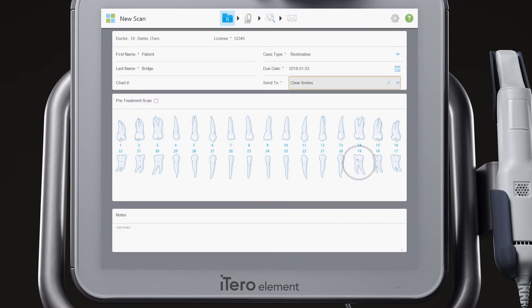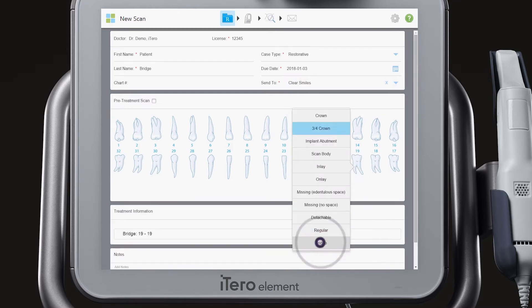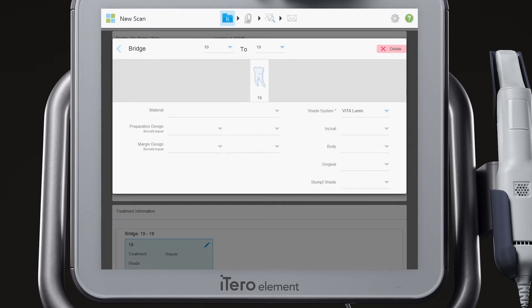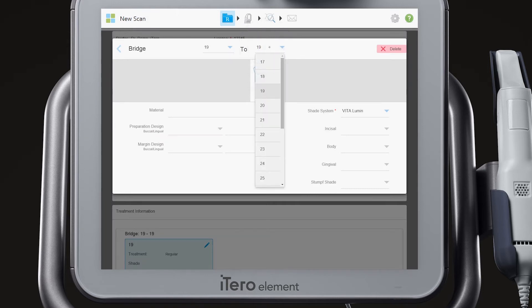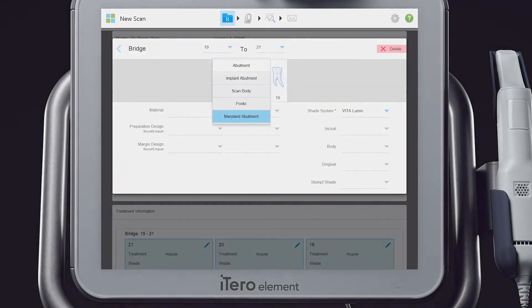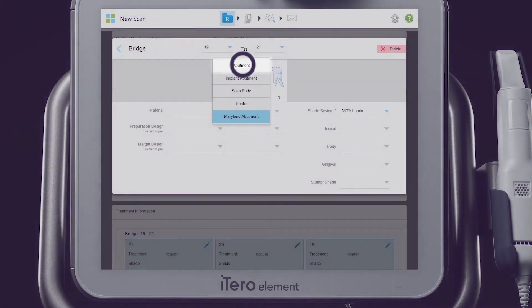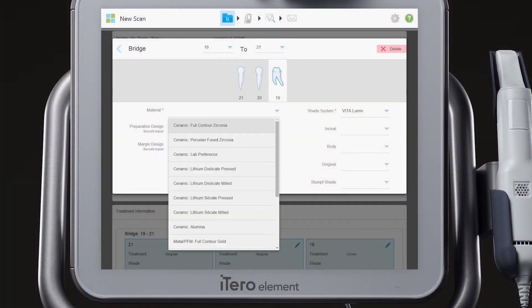Choose the first unit in the bridge on the tooth chart and select Bridge from the list. Define the span of the bridge in the drop-down menu at the top of the bridge screen. Define each unit in the bridge, completing all the required information highlighted by the red asterisk.